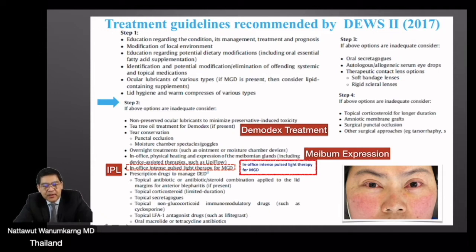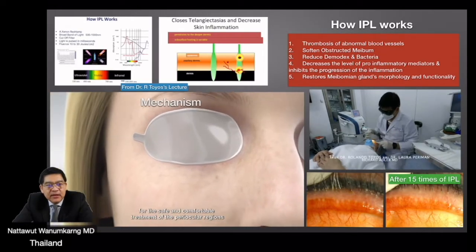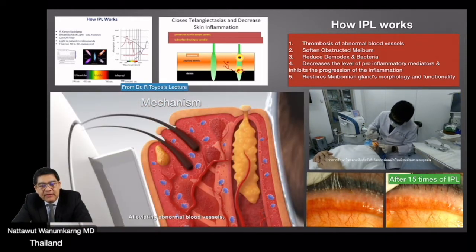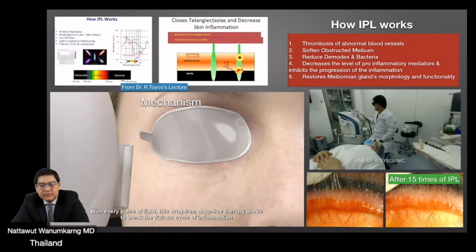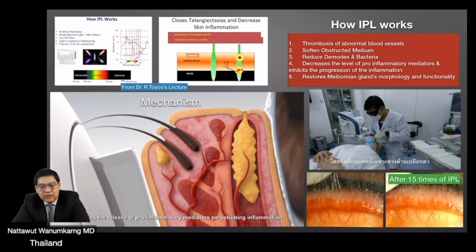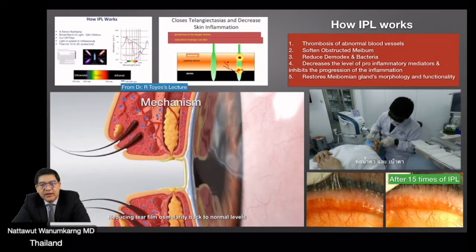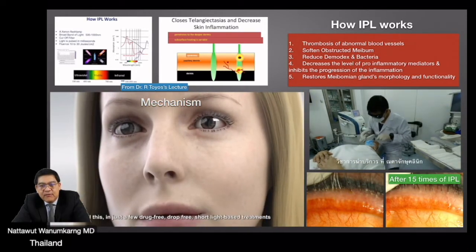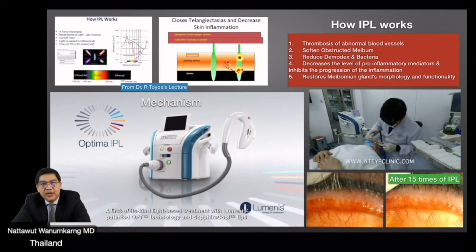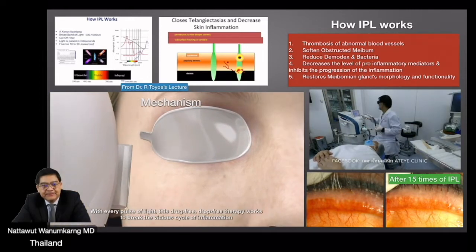In intense pulsed light treatment, the IPL is initiated from a xenon flash lamp, which emits a broad spectrum of light above 590 nanometers. The first mechanism is thrombosis of the abnormal blood vessels. Second, it softens the obstructed meibum. Third, it reduces the Demodex and the bacteria. Fourth, it decreases the level of pro-inflammatory mediators and inhibits the progression of inflammation. Fifth, it restores the meibomian gland morphology and functionality.